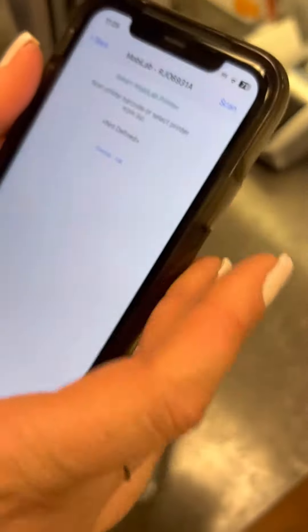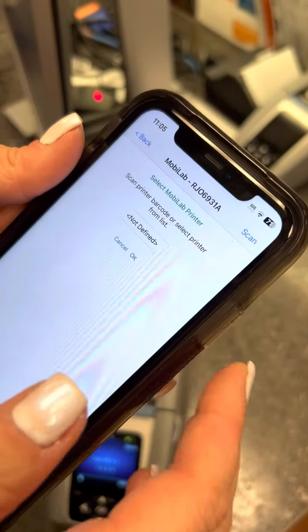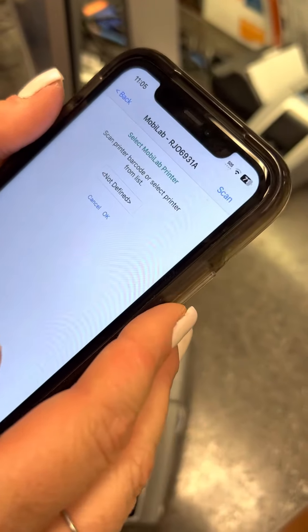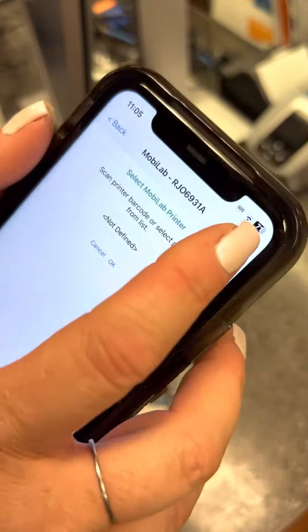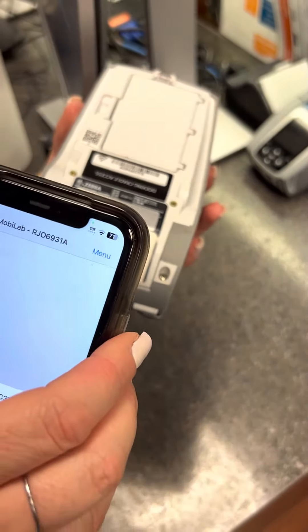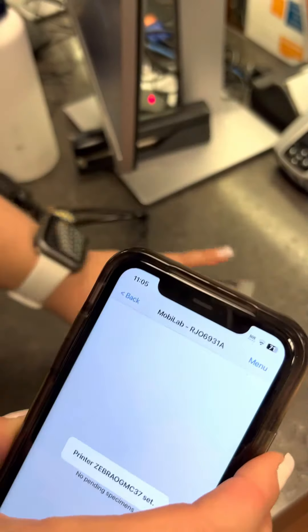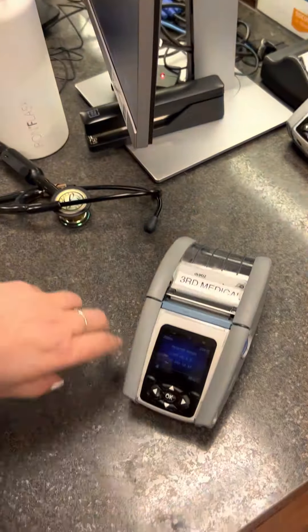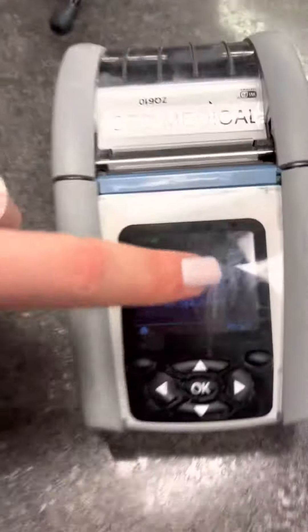Flip the printer over and scan this part of the printer — so it hooked it up. It's got the printer on there. The printer's ready.